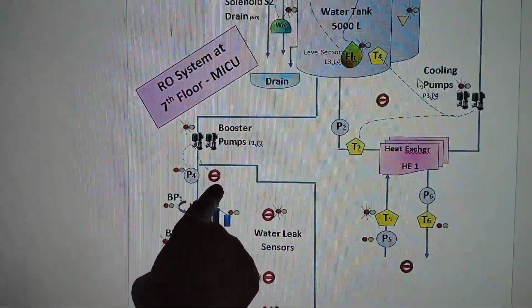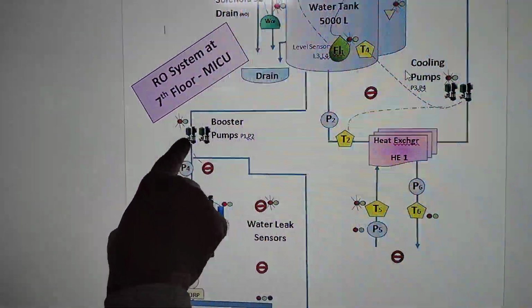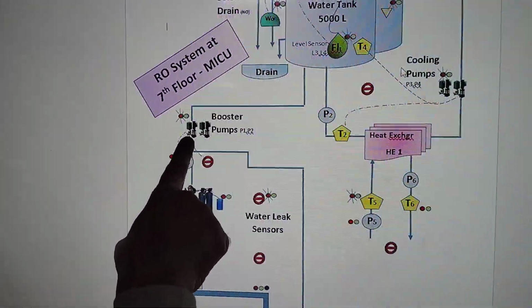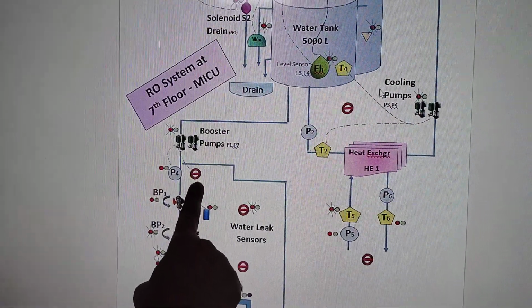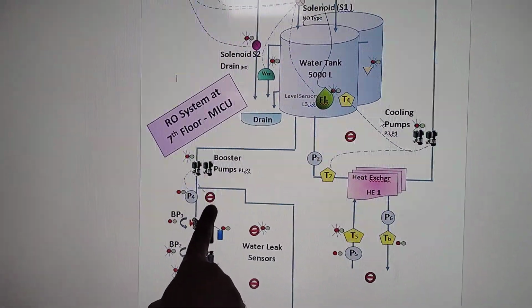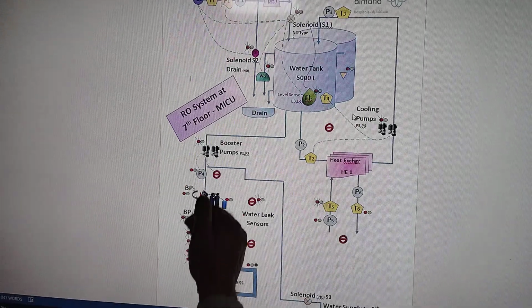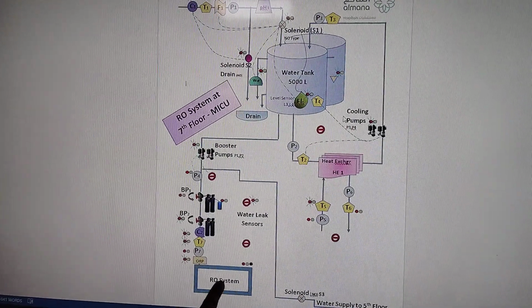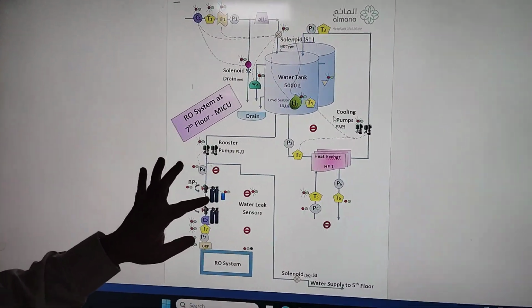When it will try to maintain the pressure of 4 bar, in case of any leak over here in this area, the leak sensors are there which will check and switch off the pump. It will not allow the pump to be on whenever there is a leak, when the leak sensor is on. So these two booster pumps work and build up the pressure and give the water to the RO system. Once the pressure is built up, it goes to the softener.